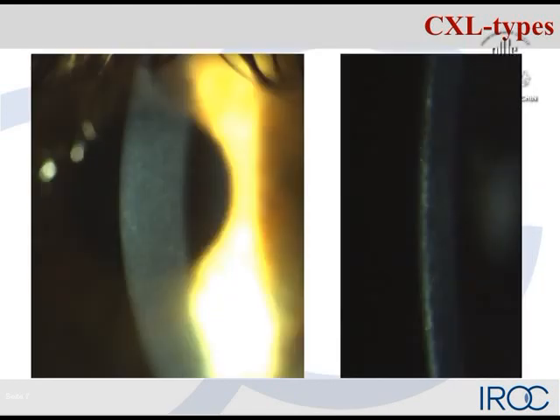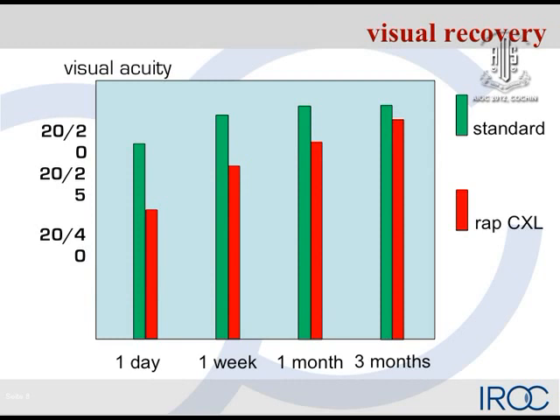You can also see it at the slit lamp. There is some haze, we do have DLK during the first 3 days after surgery, and in the small slit you can see that the haze is localized really nicely in the interface. It disappears within 3 months, as usual. But there are also problems involved.